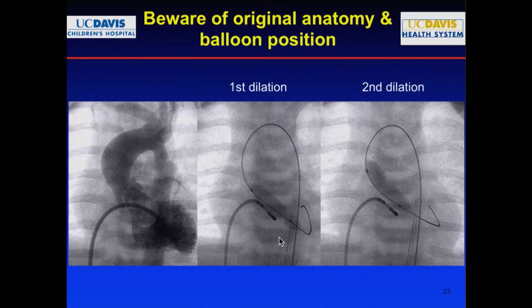If you don't know where it is, you're in trouble, because this could be happening. So what I'd end up doing is tear the mitral valve, not knowing that this area was not where I should have been. Again, had I realized that the valve is up here, and I should have known that, I would have avoided that.